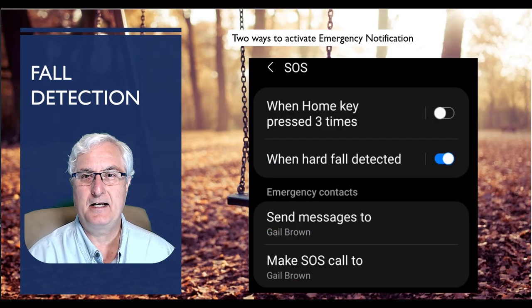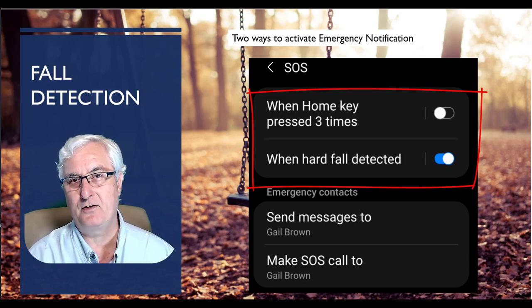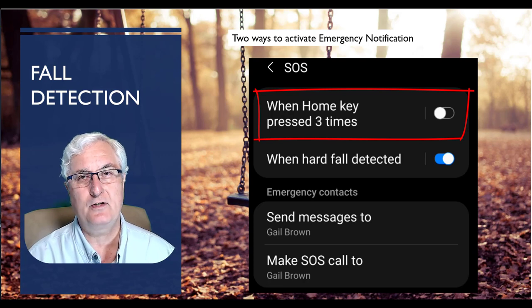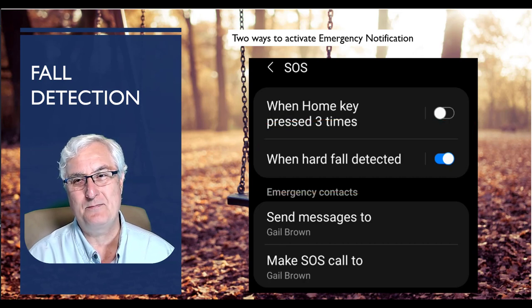At the top you'll see two options. First, you have the ability to manually send an SOS by clicking the Home button — the top button on the right-hand side of the watch — three times. This will send an emergency alert, and you can turn this on or off. This gives you the ability to manually send an alert if you fell and the watch didn't detect it automatically. The second toggle switch is for fall detection. If you don't turn this on, it won't work — it must be enabled to detect a fall.